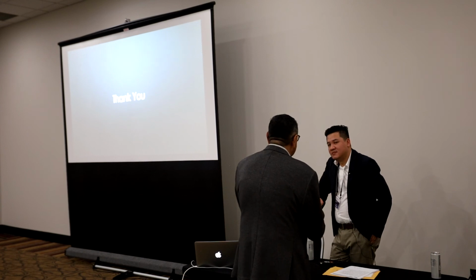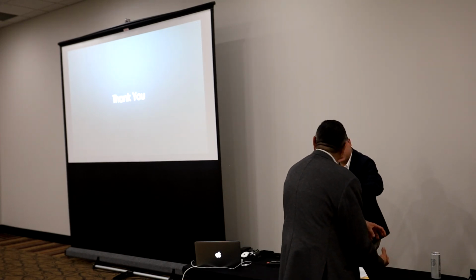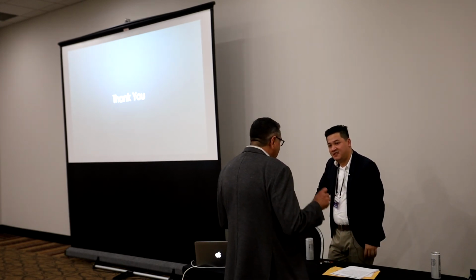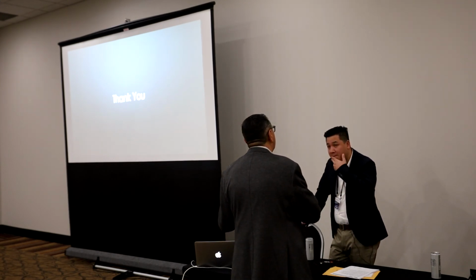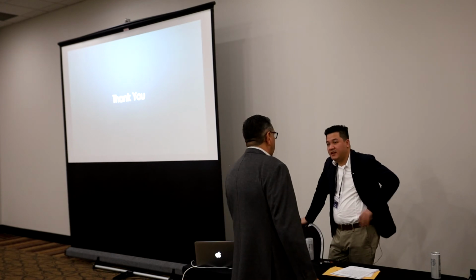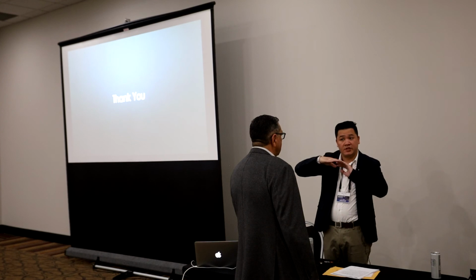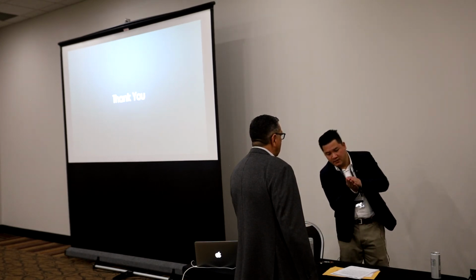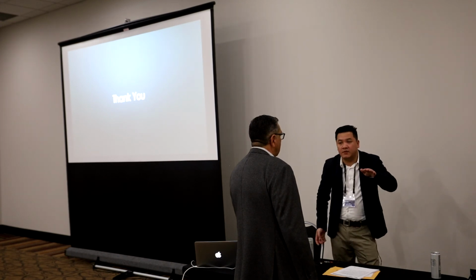I'm at that stage where I send the analog. Trust the design. We've done thousands of these. He's really good. I still believe that somewhere there is a step that I'm doing wrong, and then the bodies don't match. The articulation is really important: if you change it one degree, it changes everything. If you think of a small articulator like this versus like this, it moves very differently, and the patient moves completely differently too.